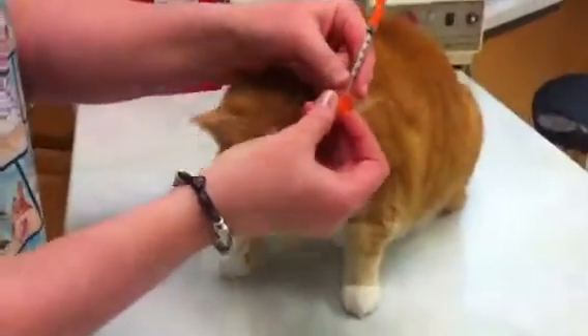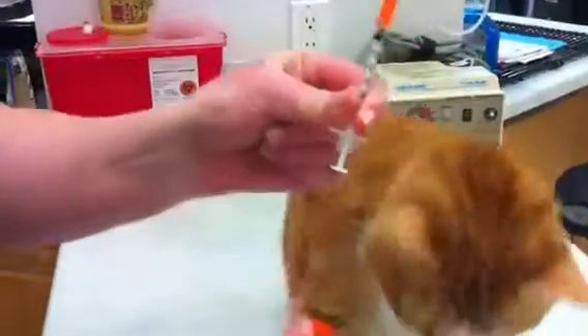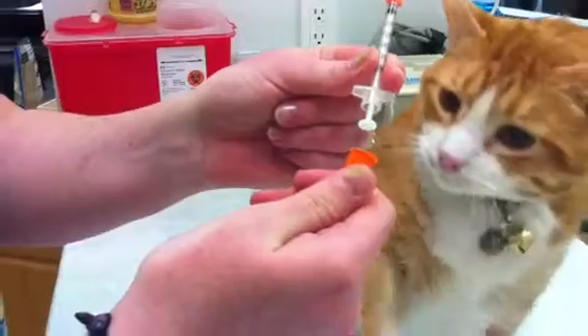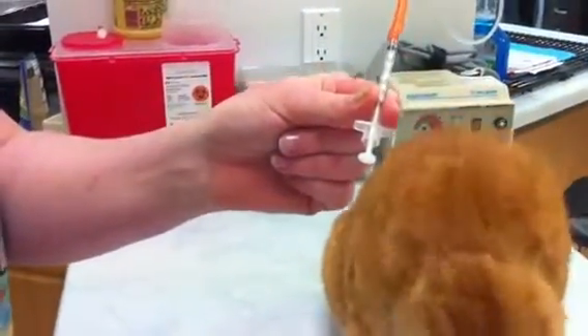This is an insulin syringe. They vary slightly depending on the brand that you get. When you first start, it has an orange plastic cap that you're going to just pull off and remove — it's garbage.